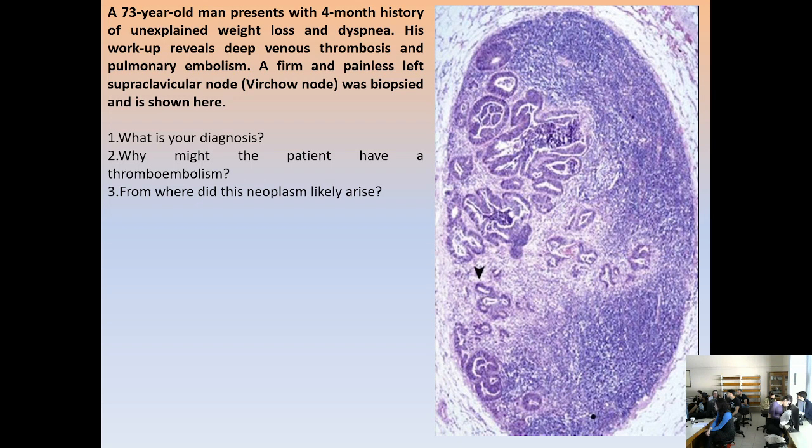Is this squamous? No. This is glandular. So it cannot come from a cancer of the oral cavity, at least from the covering epithelium, because the covering epithelium is squamous. We cannot have squamous differentiation here. So it cannot come from the covering epithelium. The esophagus? No, because the esophagus, the lining is also squamous. Other organs, where the epithelium is not squamous, the mucosal epithelium, but where the mucosal epithelium is glandular. Can you tell me other organs with glandular epithelium?